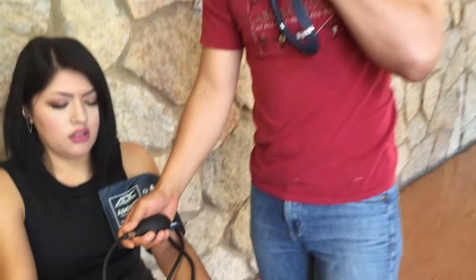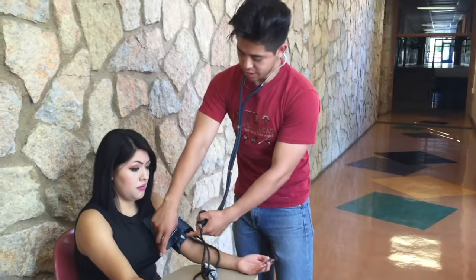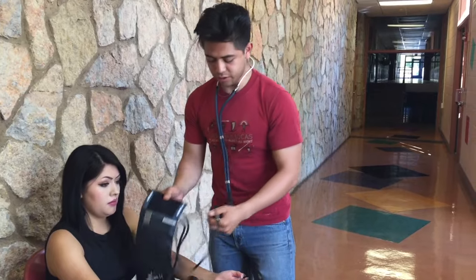So I got a reading of 110/76, meaning that she falls under the normal range of blood pressure.